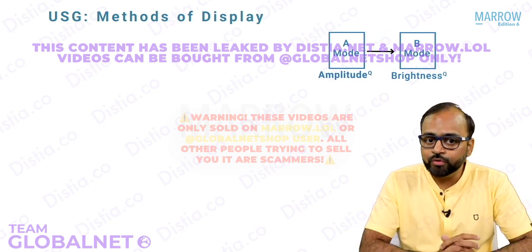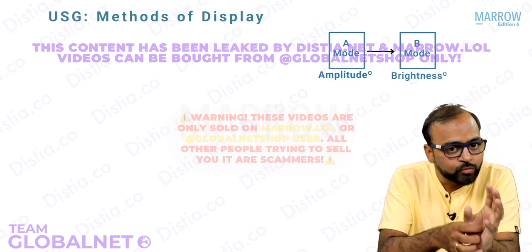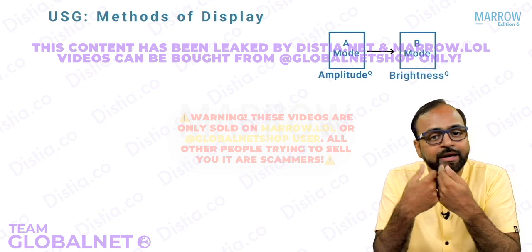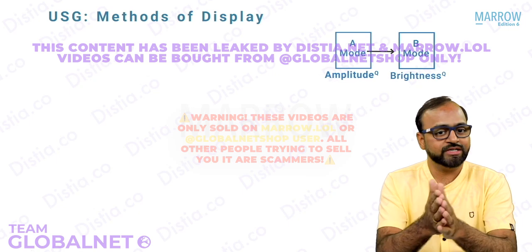And in B mode, when we construct a B mode image, this amplitude value which is measured in A mode is simply given a brightness value. Amplitude value is given a brightness value. How is it done? See here.